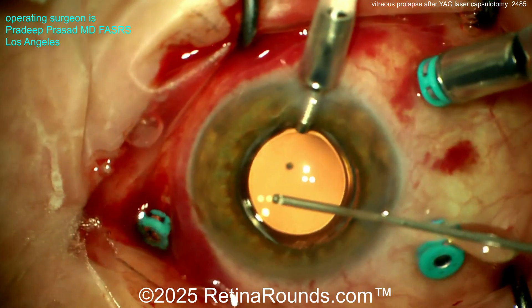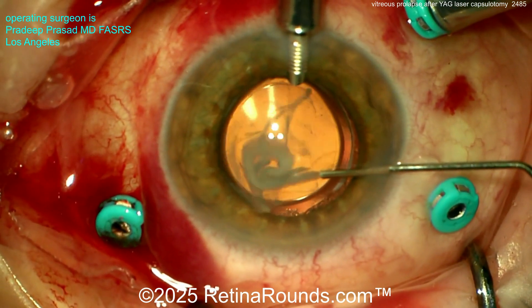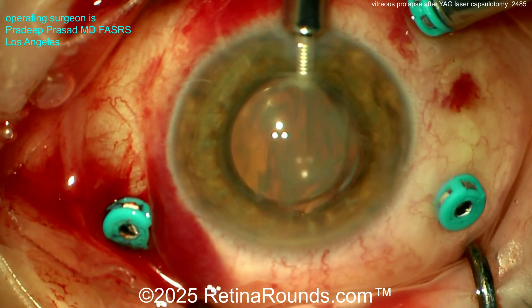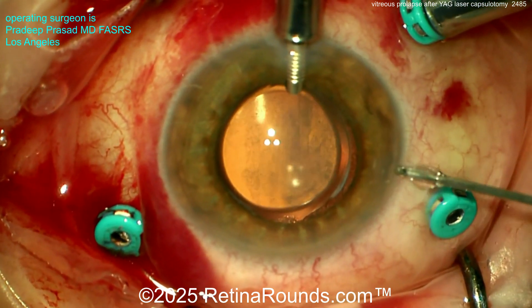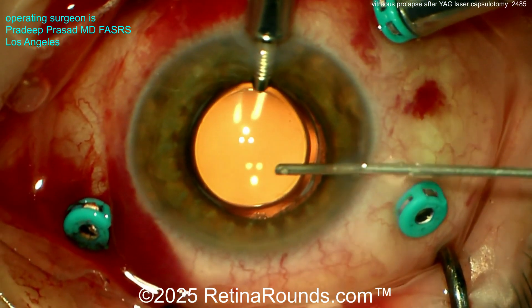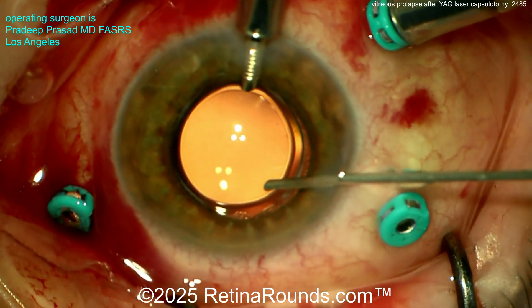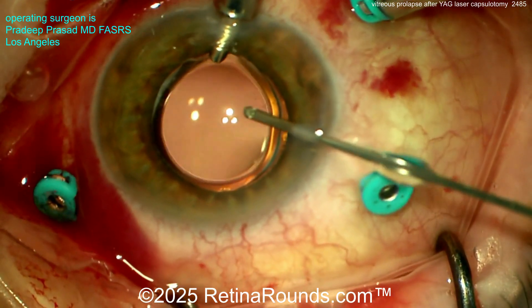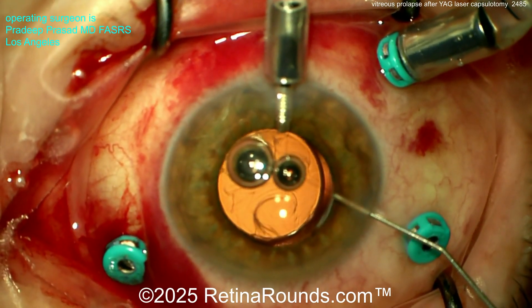Once that's done, we want to double-check that we haven't missed any vitreous. So we're going to put a little dilute triamcinolone in the anterior chamber. I highly recommend diluting the triamcinolone — you don't want heavy clumps obscuring your view, just a light dusting to reveal any residual vitreous. And actually you can see there is just a little bit of vitreous still there, so we're going to clean that up, along with a couple of other spots, to make sure things are as thoroughly cleaned as possible.